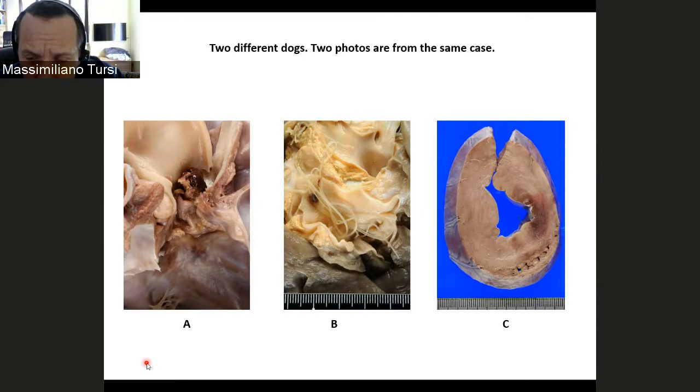But from a speculative point of view, it's possible because there is a reaction of the endothelial layer, and it's clear because there is a diffuse granular appearance, granular thickening, and of course, if there is a mechanical reaction, I'm sure there is also leukocyte infiltration. But histological presentation is better. Is it okay? Good.